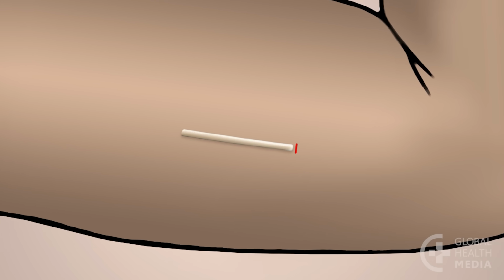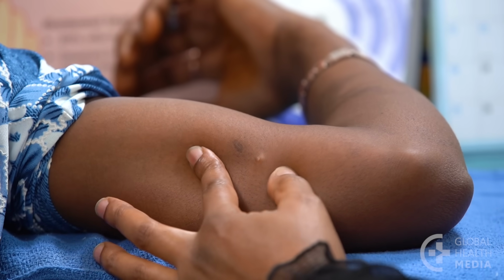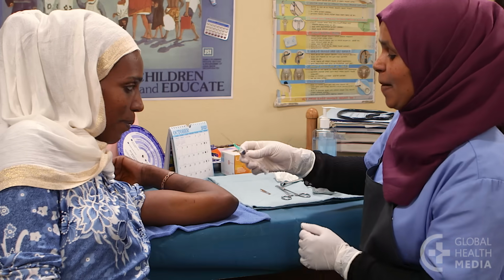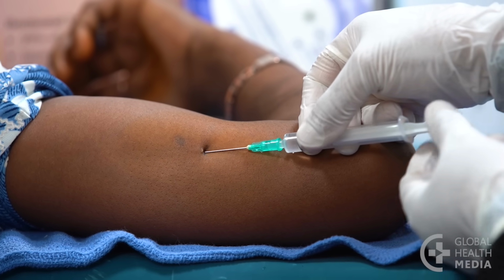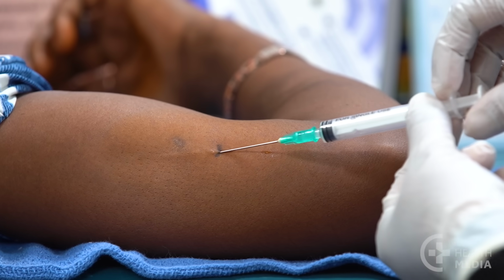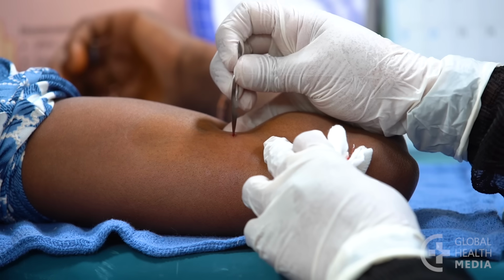Next, a perpendicular incision is used to remove a 1-rod implant. Press the implant to locate the end of the rod near the elbow. Make a mark close to and perpendicular to the end of the rod. Inject a small amount of anesthetic just under the end of the rod. When the site is numb, make a small incision at the mark.